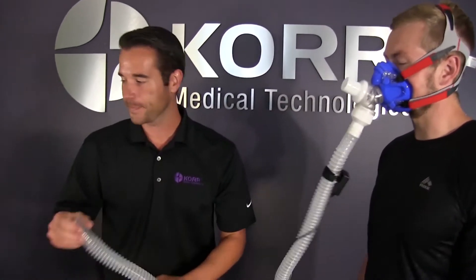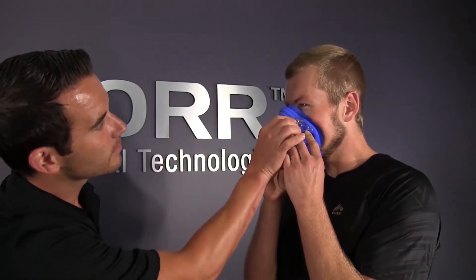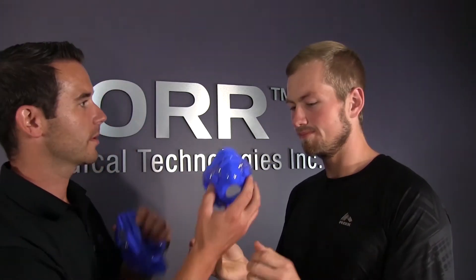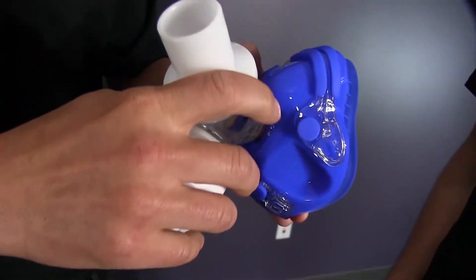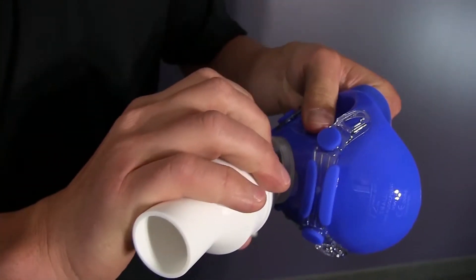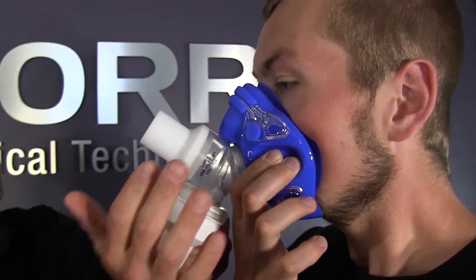In order to get accurate results, it is important to make sure your client's VO2 mask is properly fitted before you test. You can use the machine's calibration time to fit and secure your client's face mask. Begin by choosing the proper size — you want a mask that covers the mouth and nose without extending too far. Once you have determined the correct size, attach the Y-valve. Have your client hold the mask to their face and blow out as you cover the expiratory port of the valve. If air escapes from around the edges of the mask, it is probably too large and you need to change the size, as any air leakage will affect the accuracy of the test results.